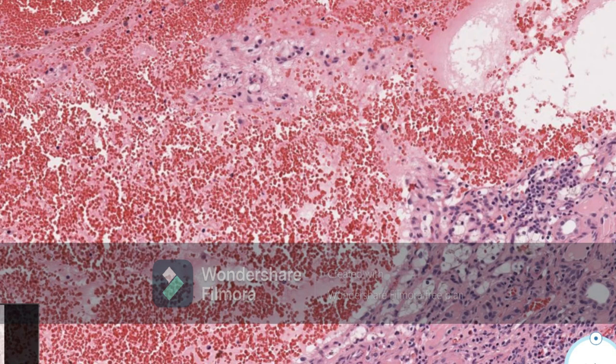In the kidney, you can see a solitary, well circumscribed lobulated mass, which is involving the renal cortex with characteristic golden yellow color. This golden yellow color in the gross picture is due to the intracytoplasmic lipid. That is why a renal cell carcinoma is typically yellow in color grossly. So when this slide is kept for your exams, you should pick up the diagnosis and write this as clear cell carcinoma of kidney.